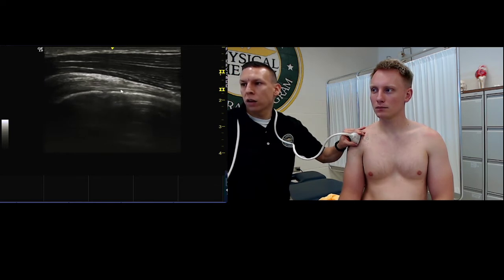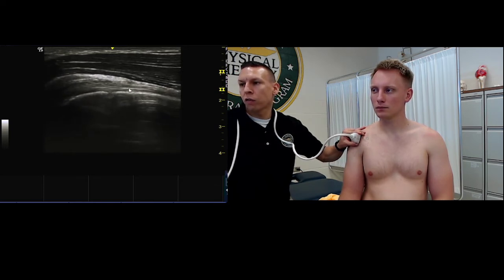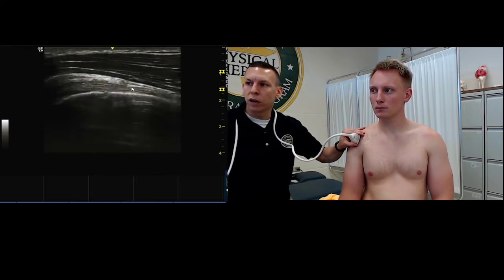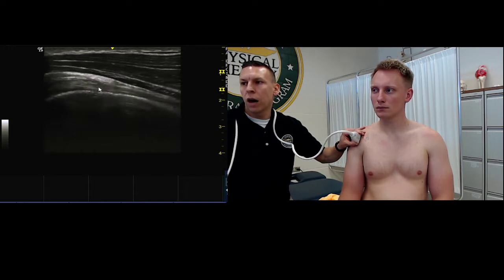And so right here is the long head of the biceps, and we're looking for this very bright fibrillar pattern going left to right. And we're looking for any fluid or any kind of pathology along there.